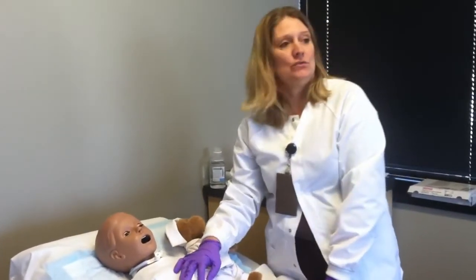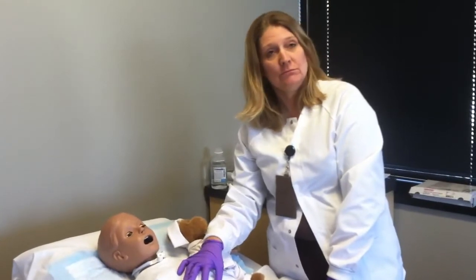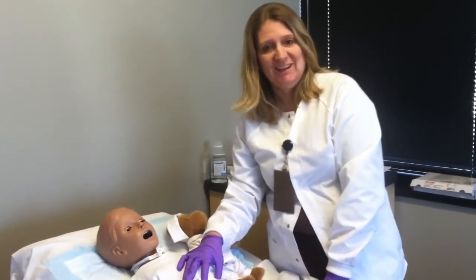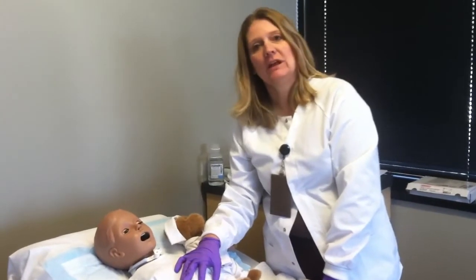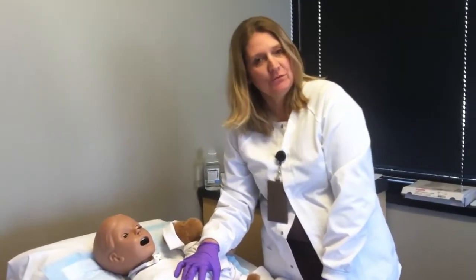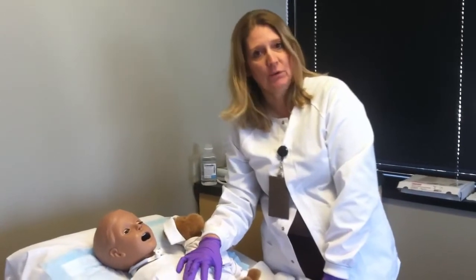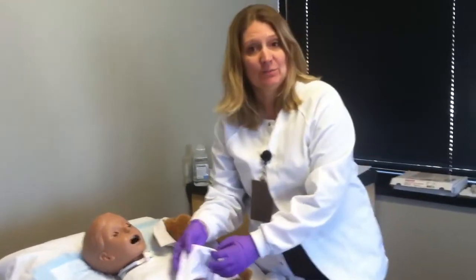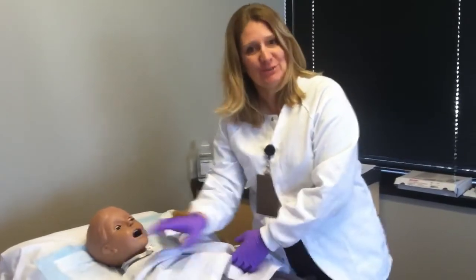GTube Care happens twice a day at the very minimum, BID. And more often if there's more drainage. You're going to have to do it more often, even up to every 3 or 4 hours if there's a lot of drainage being produced. So just so you know that as well. And that is how you do GTube Care.